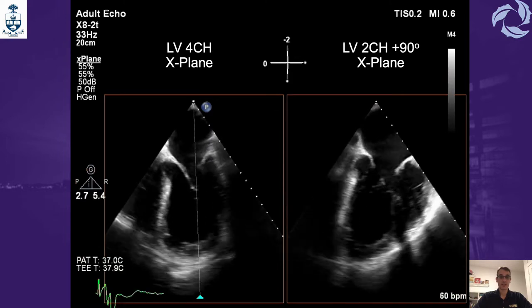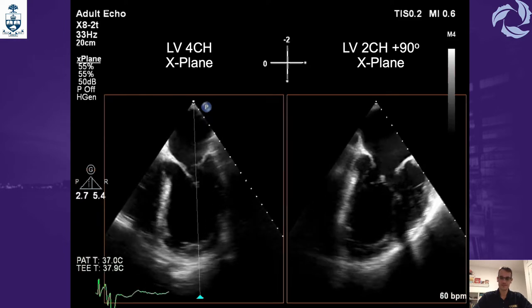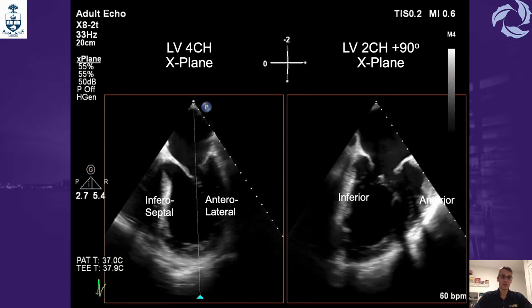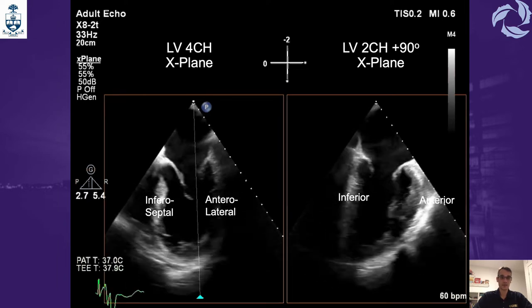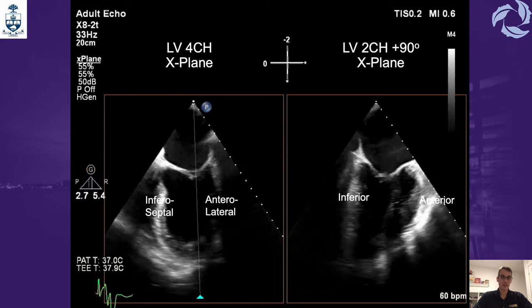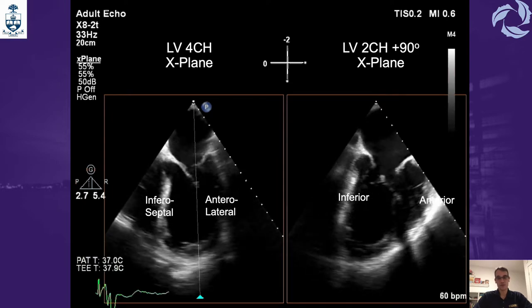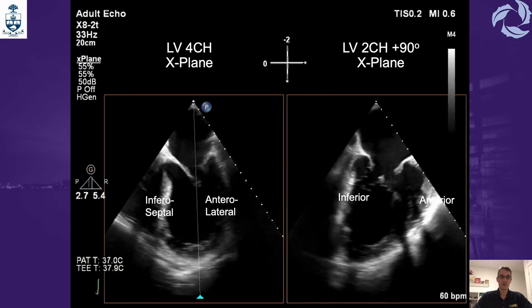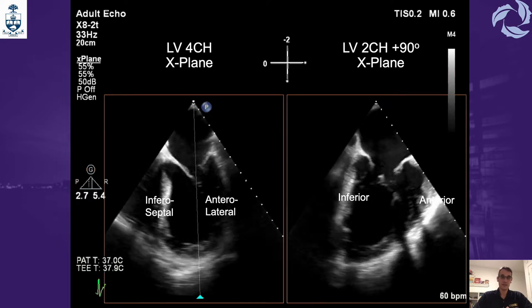Using X-Plane we can assess simultaneously four walls of the left ventricle starting at the four-chamber view. In this example, on the left side of the screen we are showing the LV four-chamber view where we have the inferoseptal and the anterolateral wall. By applying X-Plane over this view we generate a 90-degree plane shown on the right side of the screen, equivalent to the LV two-chamber view, exposing the anterior and inferior wall. Both views are simultaneously assessed and separated by 90 degrees.